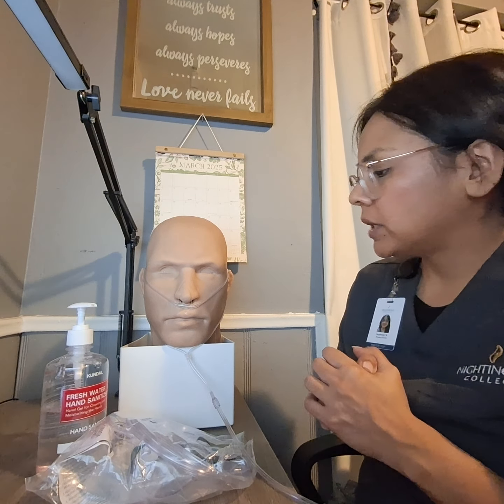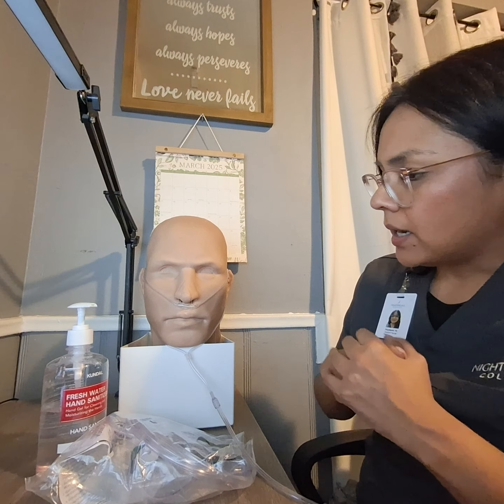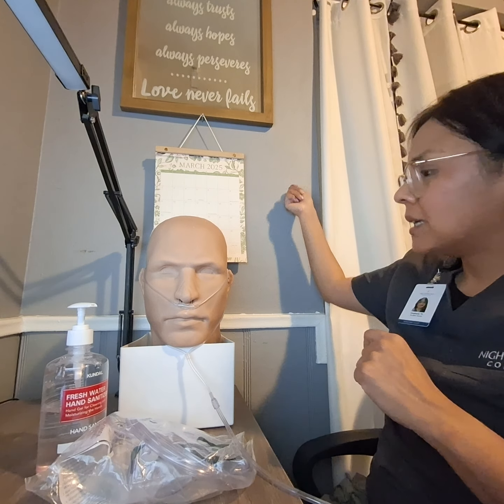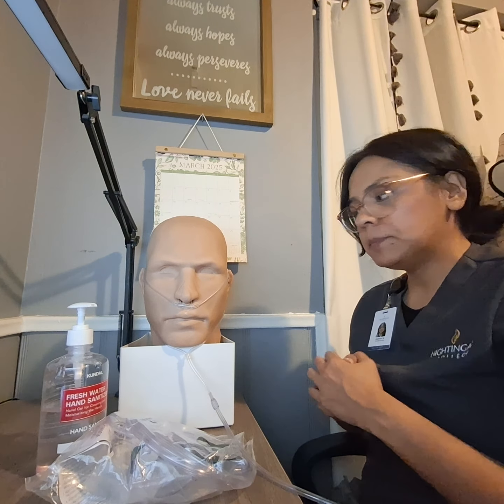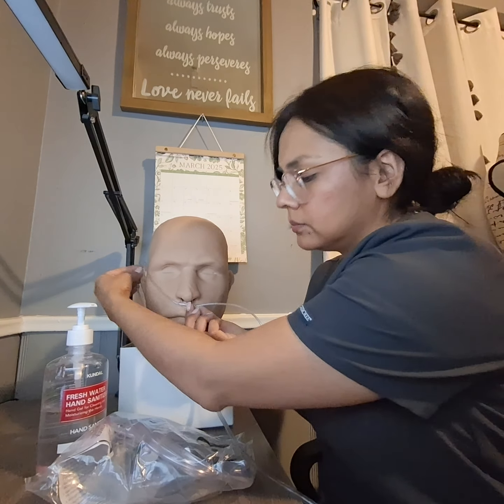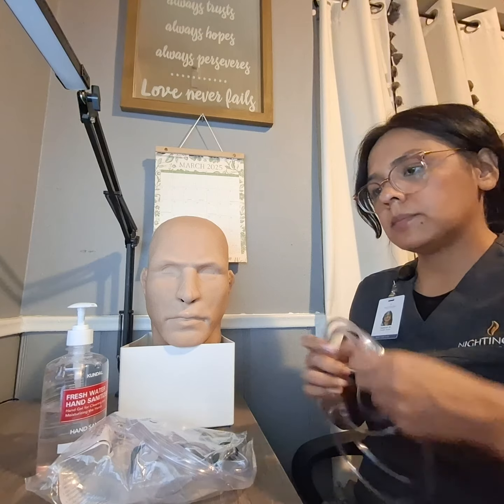Mrs. Garcia, so the oxygen is still a bit low. So the doctor has ordered a non-rebreather mask to help you breathe better, okay? I'm going to go ahead and disconnect the tubing here for the nasal cannula. Remove the nasal cannula. I will go ahead and toss this in the trash.